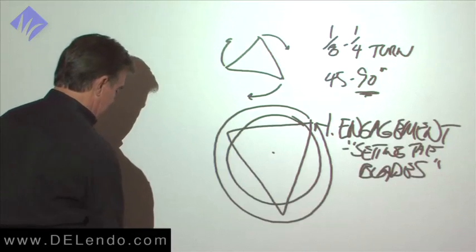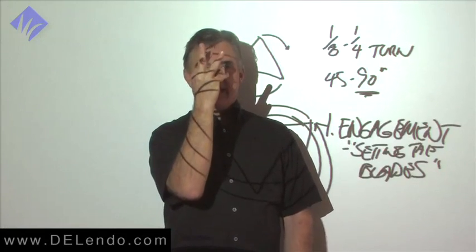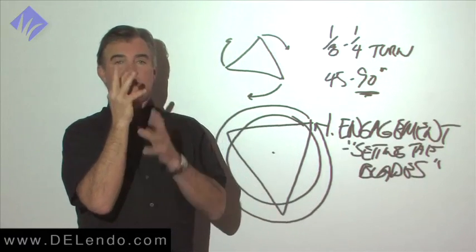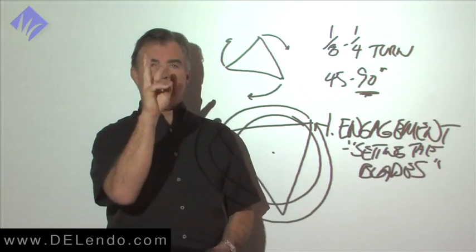Okay, so what does that look like? Well, here's the blade ends. We set the blades, and then with no pressure, if I push on the blades when I engage this, then I'm going to get the blades over embedded. And again, if they're over embedded, I could twist them off. So I lightly set them, no apical pressure.